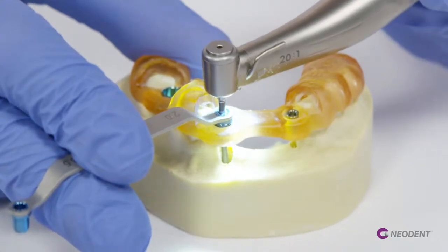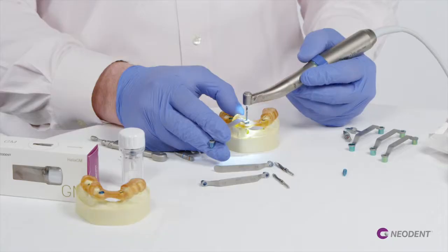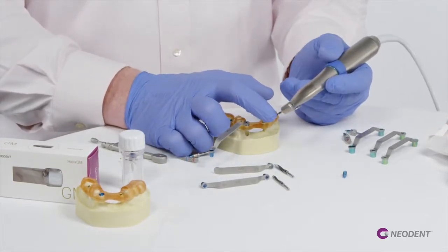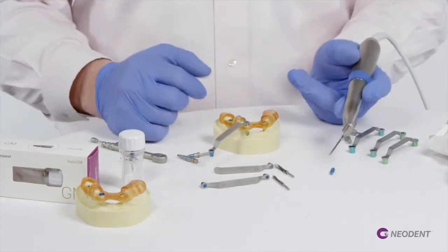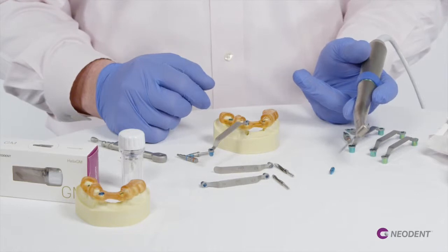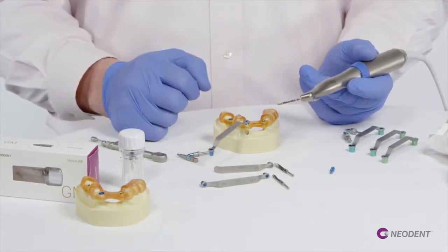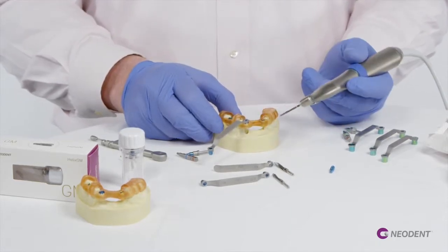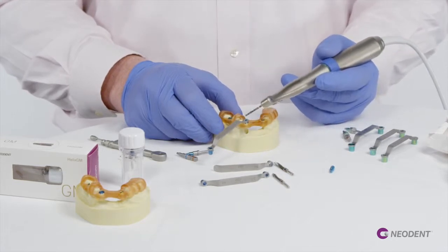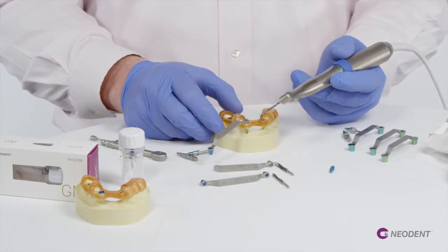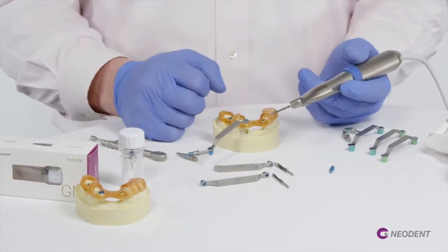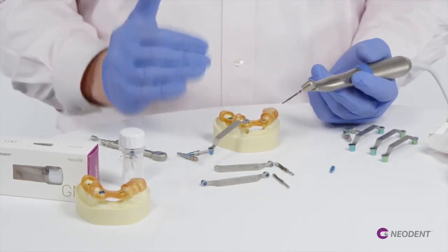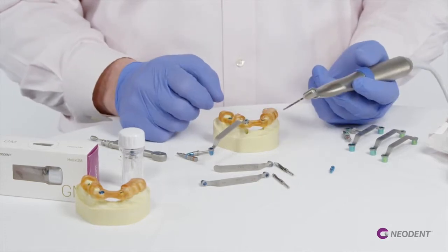With irrigation and our drill set at 800 or less RPMs, we're actually going to drill to 11 and a half on the side of our guided drill. We're doing this because we're using a 4.3 by 11 and a half implant. With our guided surgery system there's a plus 11 added to our drills. This is because of the offset on our guided surgery sleeve at 9 millimeters and then placing the handle on top adds an additional 2 that makes us our plus 11. There is an option to also do an offset of 11 versus 9 on our guided sleeves where there's thicker tissue.